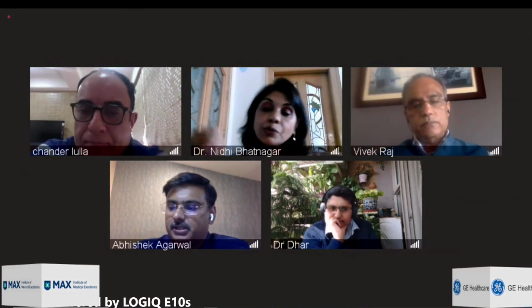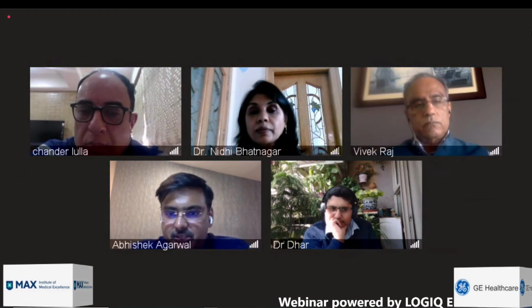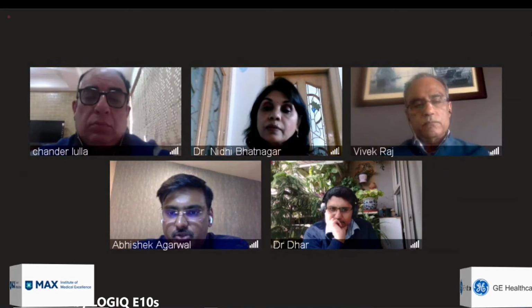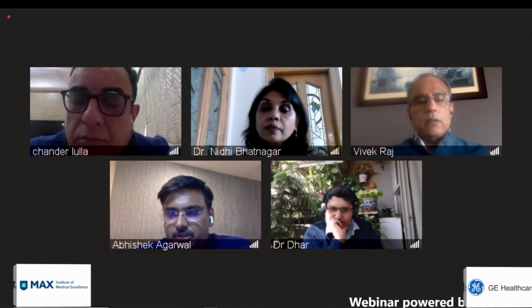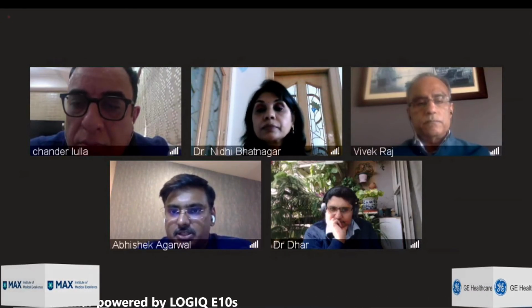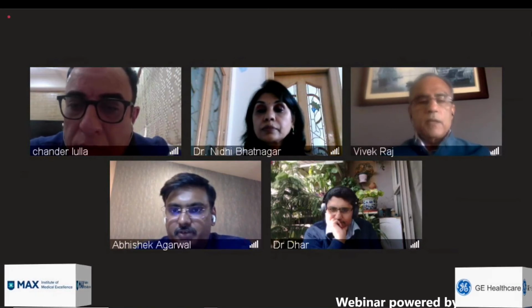That's very true. So if a patient has reached the stage of SVR in a viral hepatitis, it must be a good idea to get a baseline study once the SVR is obtained, and then follow up and see. And maybe not a bad idea if you could recommend that he or she should get it done from the same place and the same person for the sake of regularity. Right. And that's why I think our report template should mention, as Dr. Nidhi said, which machine is used and which probe was used and which technique was used. So for follow-up, we ideally use the same kind of equipment.